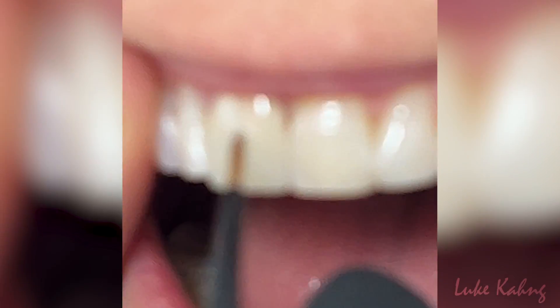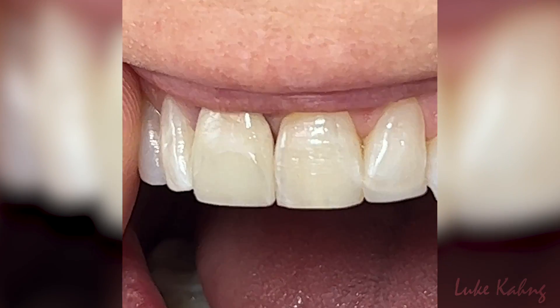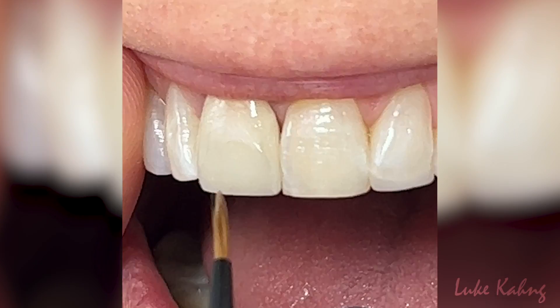Apply the white calcification a little bit — you see? Then I need a little more color.